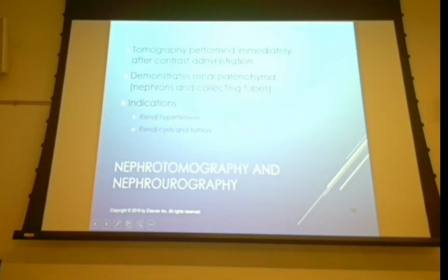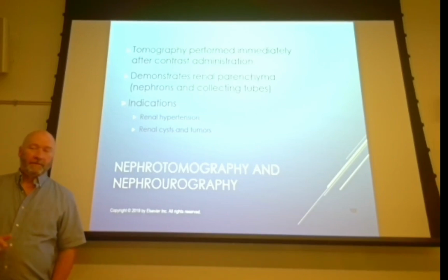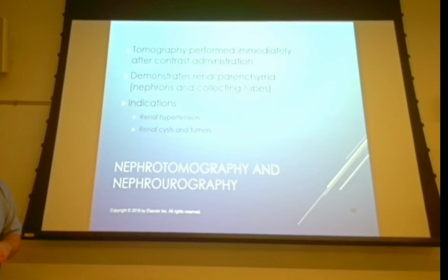So, all right, again, we're not going to talk about nephrotomography, but I do need to talk about voiding cystourethrogram. All right, so I've never done one of these, and there's good reason for it. So if you've got a pediatric patient, and the history is usually young girls. If you've been through A&P 1 and 2, you know that most pathologies affect males more than females, but in this case, it goes the other way. It's more little girls than little boys.